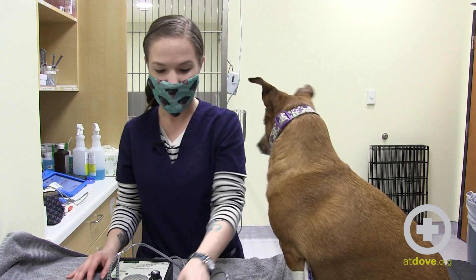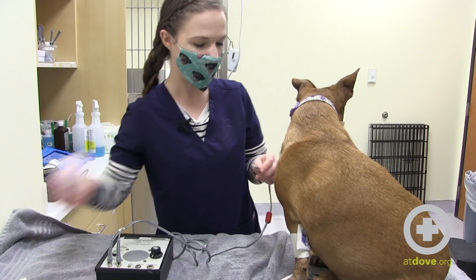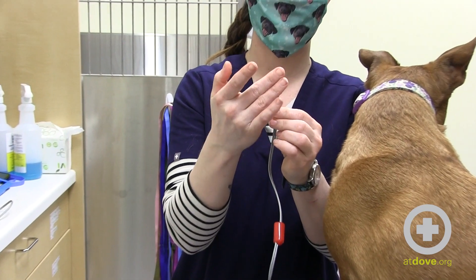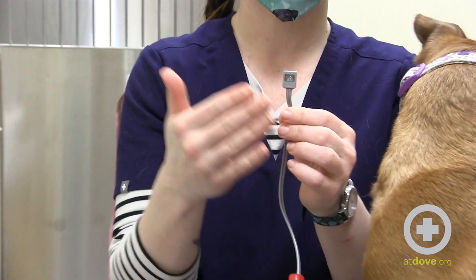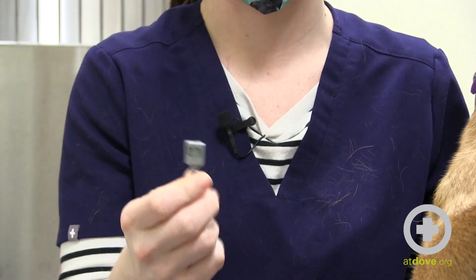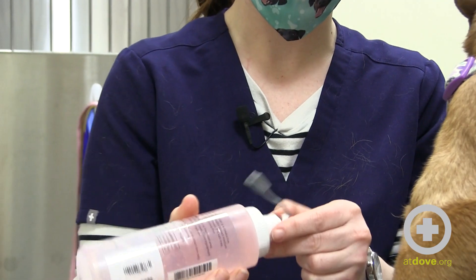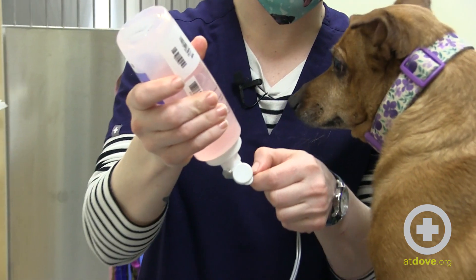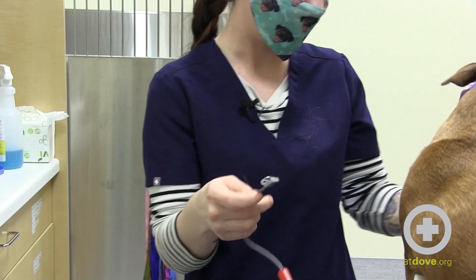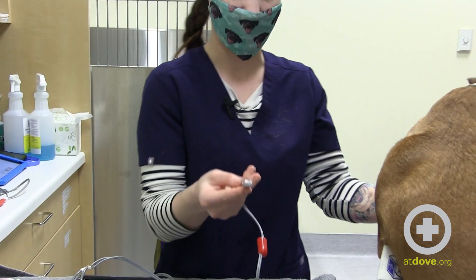So we're going to go ahead and get this crystal with some ultrasound gel. We use the indented part — this side will not transmit. If you're going through a rush or aren't paying attention, I've definitely gelled the wrong side and wondered why I can't get a reading. Just make sure we're using the indented side. Be really liberal with this ultrasound gel — if you don't have enough gel on, it will not transmit the sound appropriately or it will be really quiet. So you really want to put a nice big glob on here.